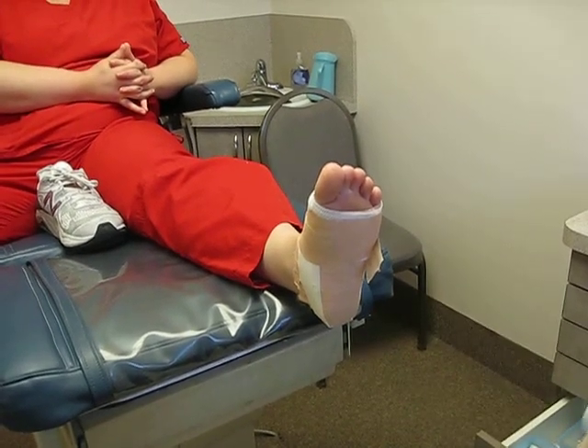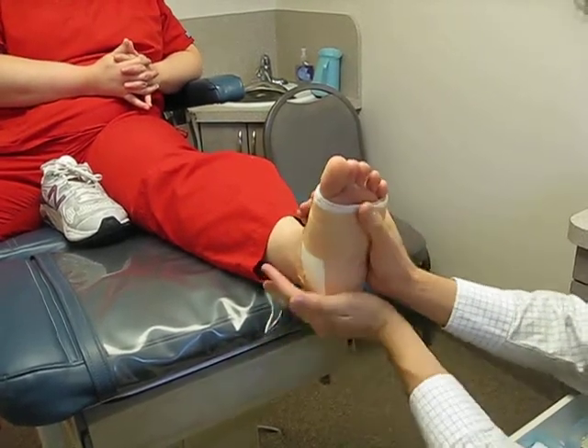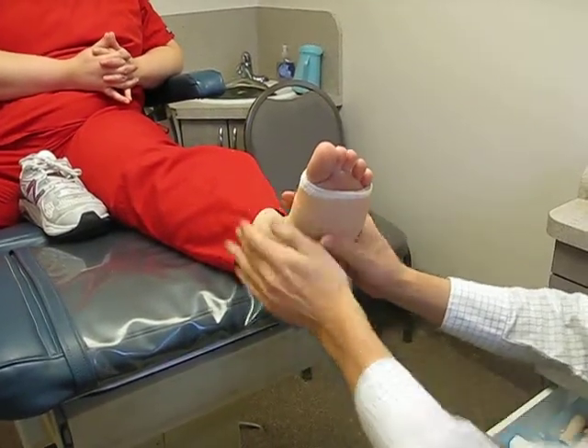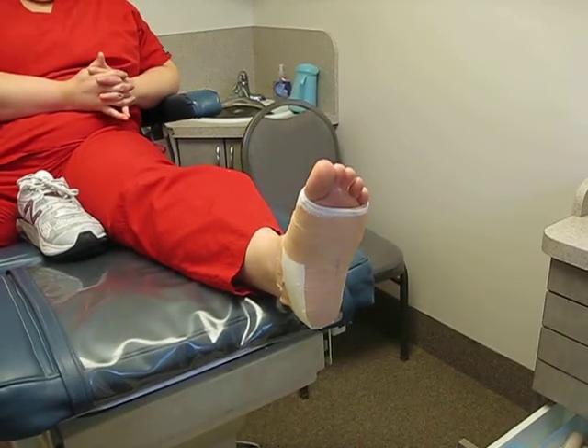And you're done. At this point you can take a piece of wax — meant for skis or a candle — and rub it down. That makes it very smooth, so you can get your socks and shoes on without rolling up little layers of the tape. And that's a modified low dye strap. Thanks.